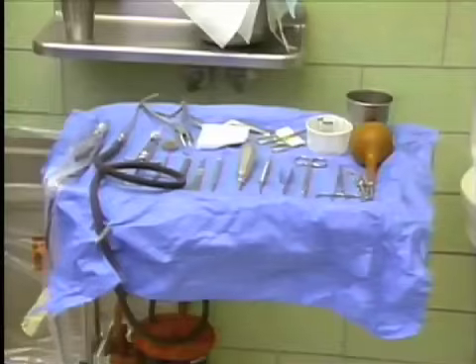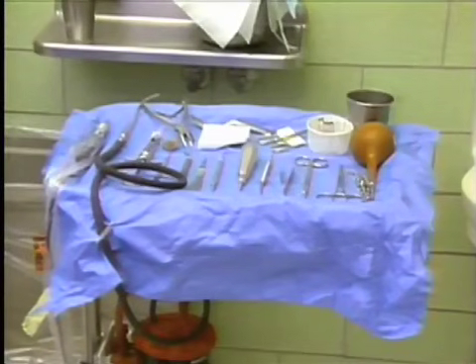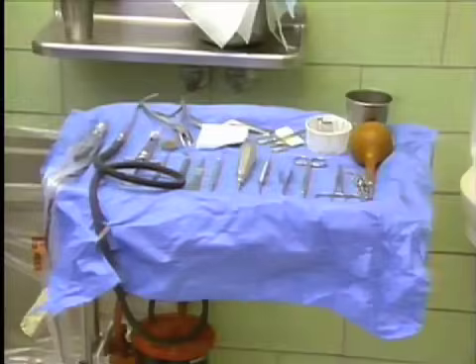The pack is placed over the operative field, a moistened pack so that it does not adhere to the mucous membranes. Throughout the procedure, the bracket tray should be maintained in as orderly sequence as possible. It is this neatness and arranging of instruments that is a part of the assistant's role.